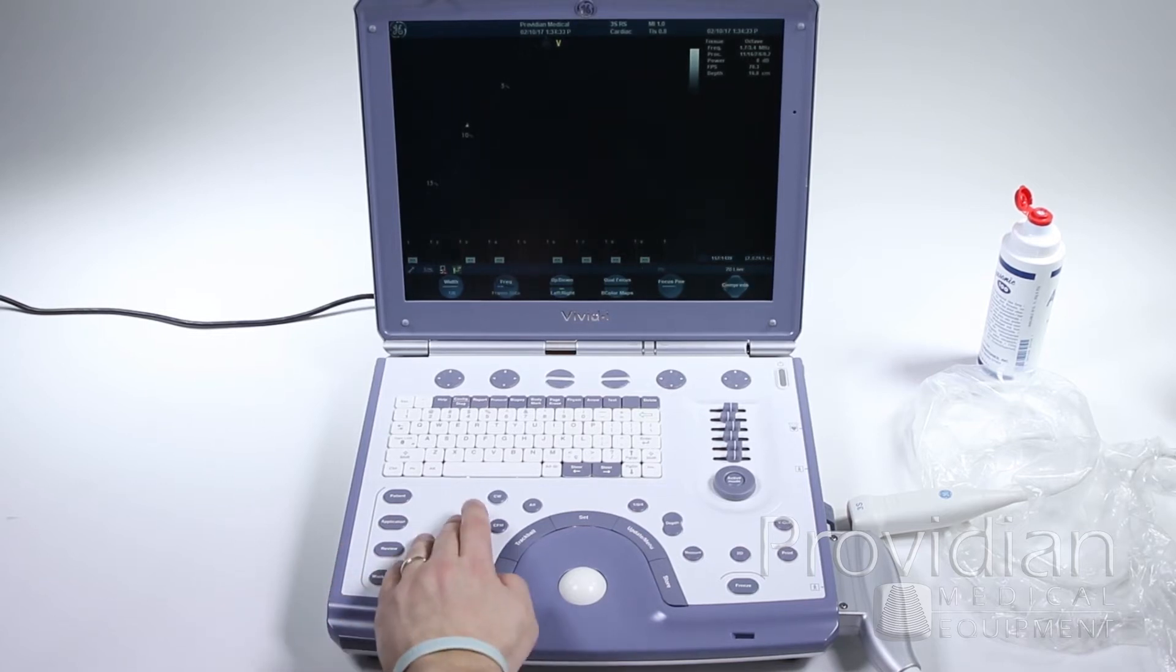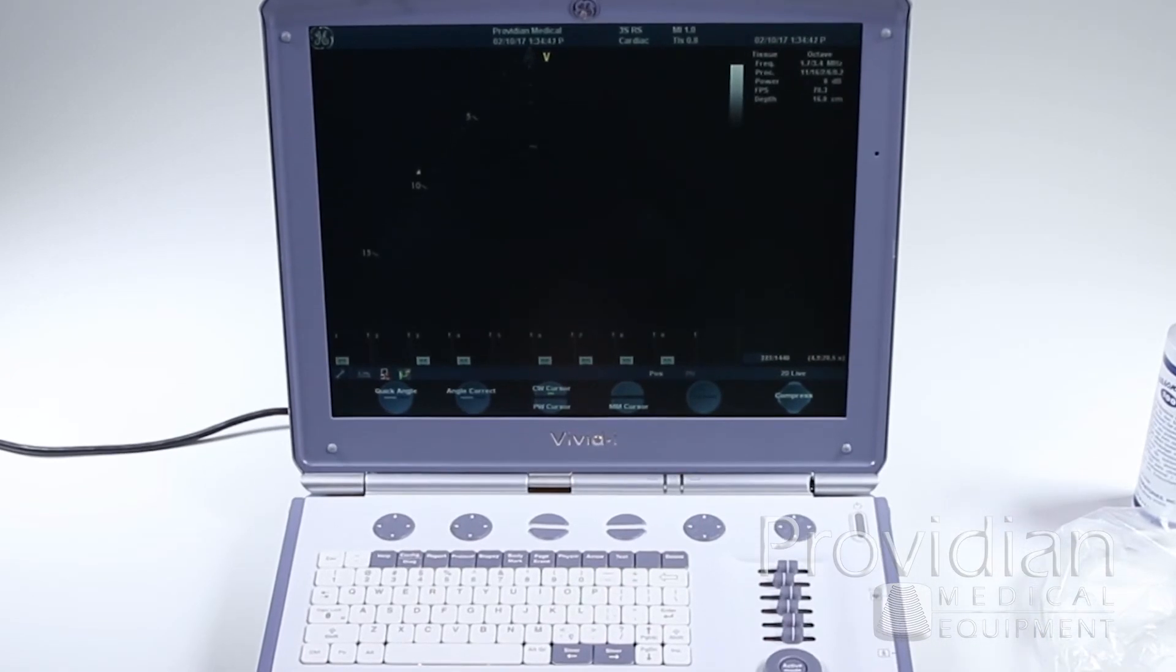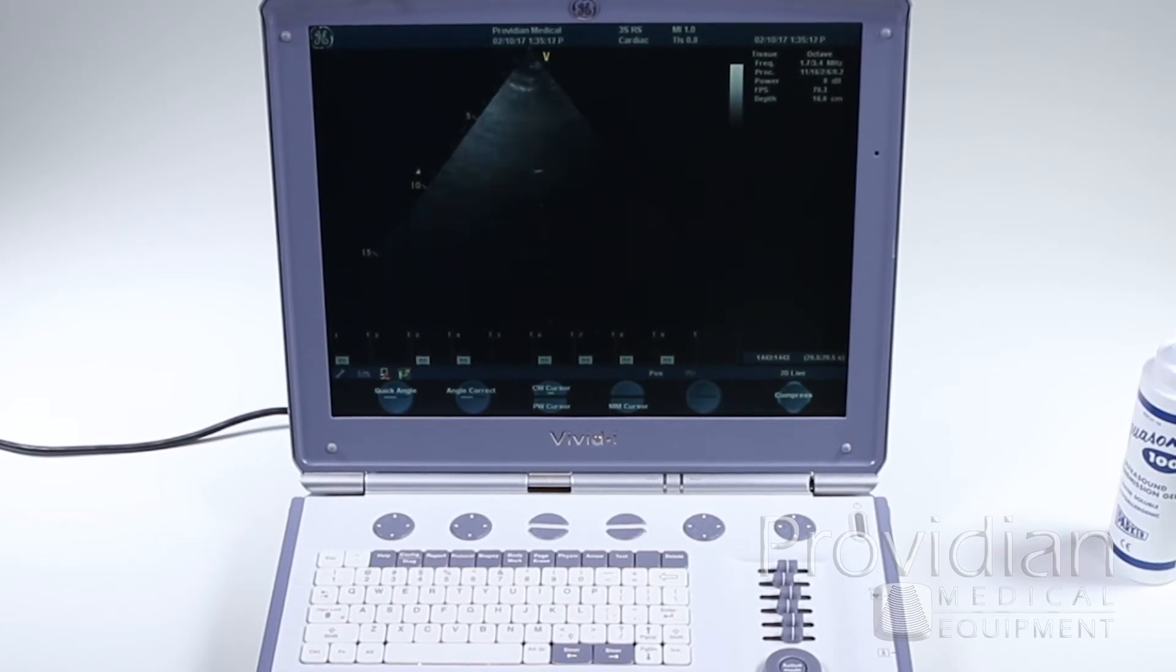A lot of times, instead of hitting pulse wave and then getting the gate and going to that image and going back to 2D, you can click your cursor here. So for M-Mode, PW, or CW Doppler, you can get that full screen on there and decide on where you're going to put that gate.